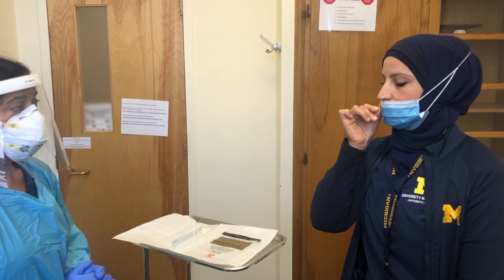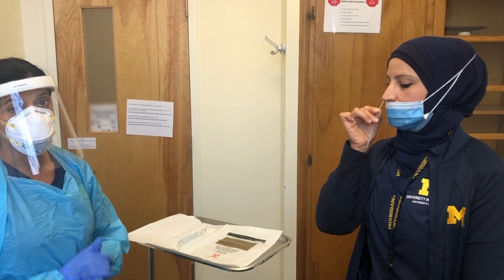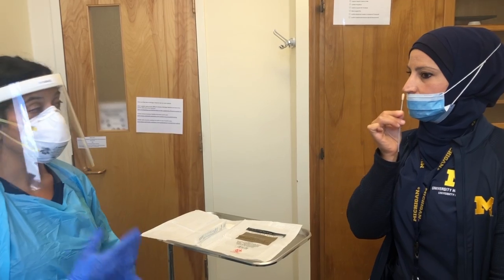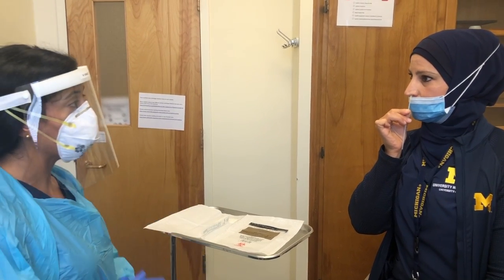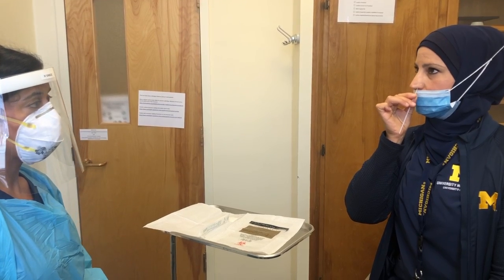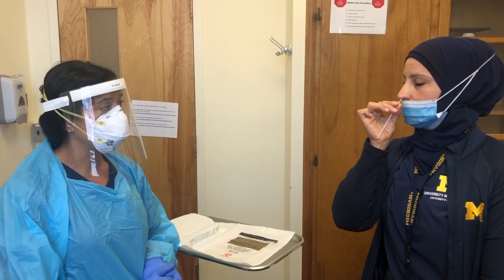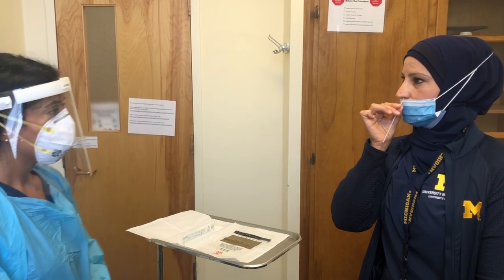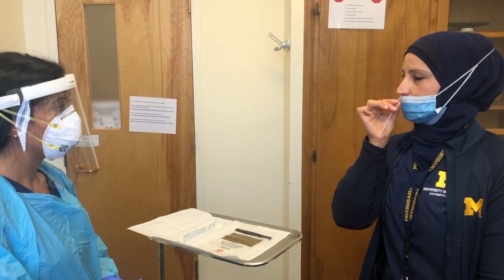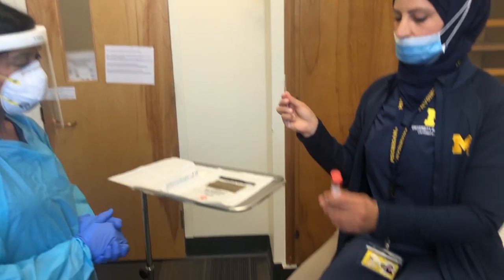Nice job. If you find that they're not far enough, they might be only swabbing their anterior nasal portion of the nostril, at which point you want to try and help correct them. That's great. Go ahead and do the other side. Again, she's swabbing 4 to 5 times, making sure that she makes contact with the nasal wall. Nice job. So now you're going to uncap your tube.